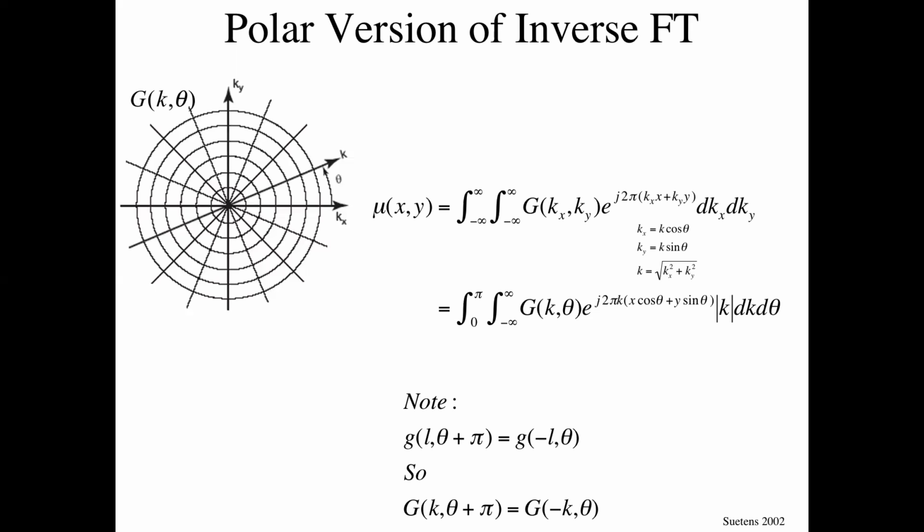The direction is flipped. So when I go over 180 degrees, all I do is flip L. And that in the Fourier domain tells us this.